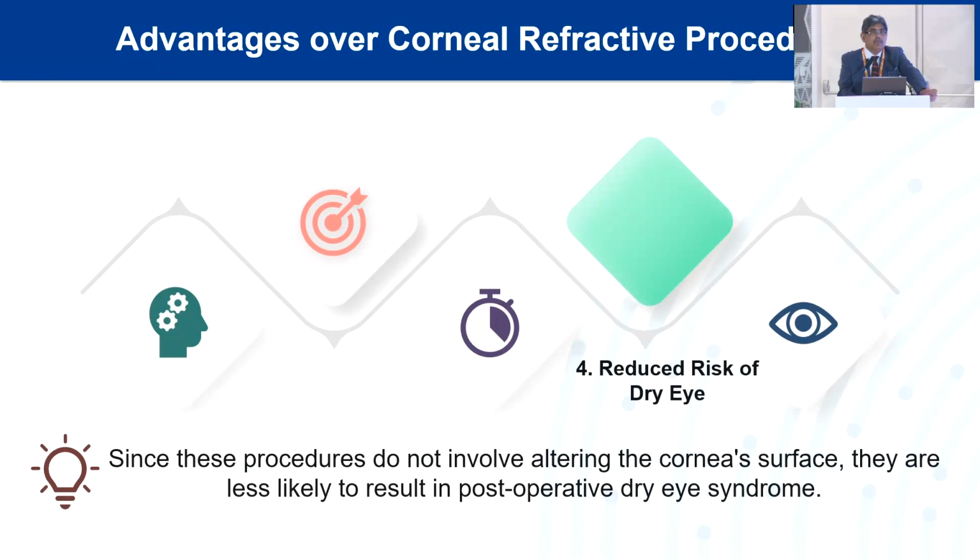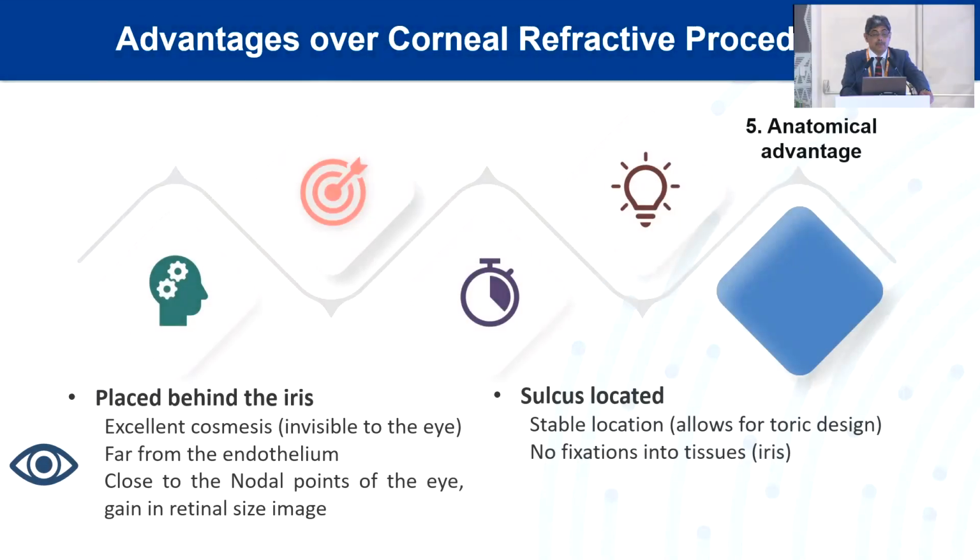And because we are not cutting the corneal nerves largely, the chances of dry eye development are unlikely as compared to the corneal surface procedure.